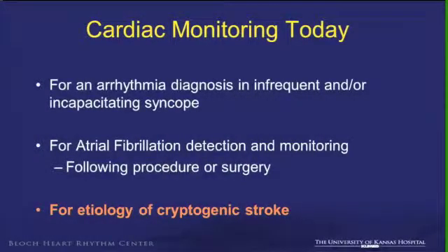So again, going back to what I had talked about previously, how are we monitoring patients today from a cardiac standpoint? I've already talked to you about different ways to diagnose infrequent or incapacitating syncope, and we're not going to touch on atrial fibrillation detection and monitoring, although I really struggled hard before I decided which of these two I was going to talk about, because I think that's another burgeoning aspect of remote monitoring, or monitoring in general, and cardiac monitoring following procedures and surgery, as we try to determine who it is that we can discontinue anticoagulation and who is at risk for stroke.